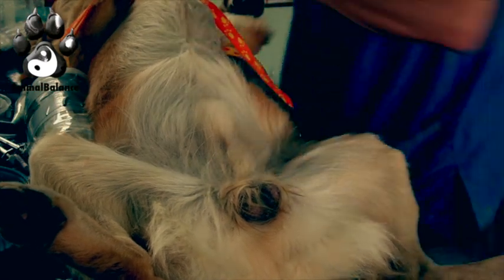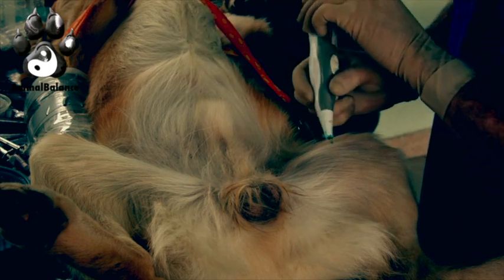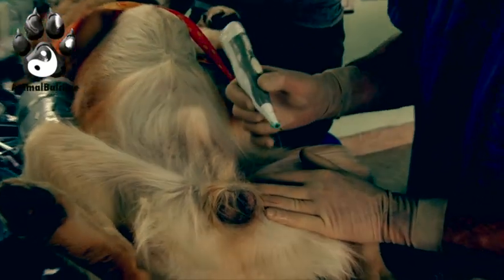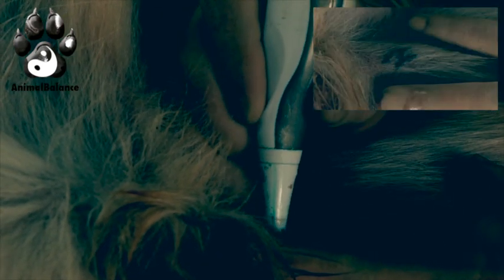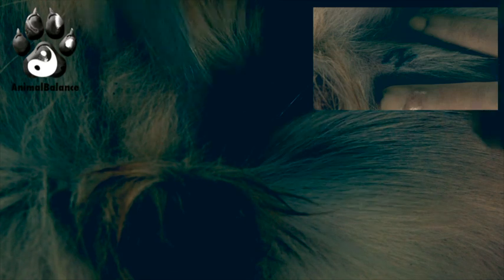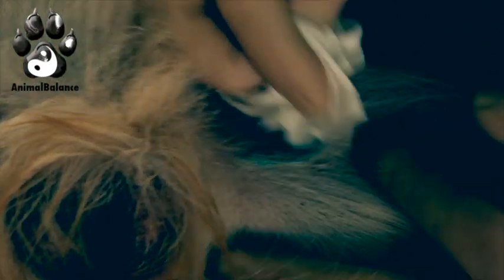We also need to put a marker on the dog, because dogs with sterilized testicles need to be identifiable later on. The marking technique we're using is an electric tattoo device. We put on a very small Z using two parallel lines and then come back with a diagonal, completing the Z mark.